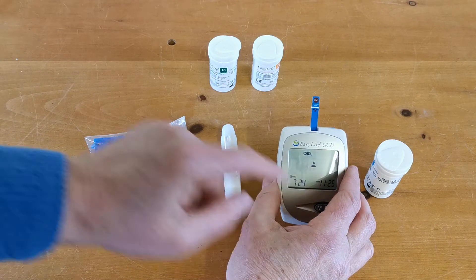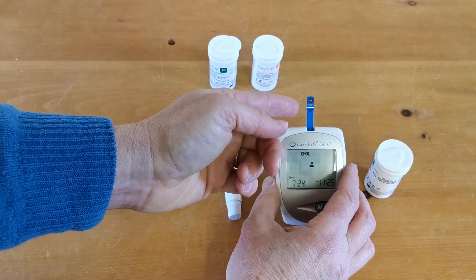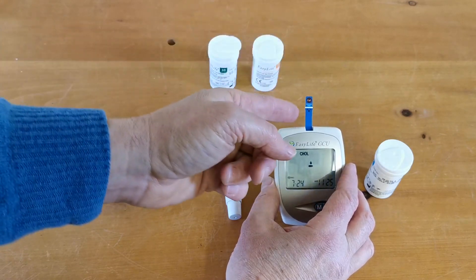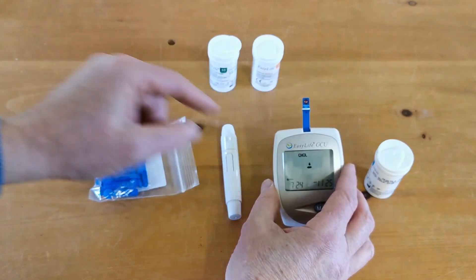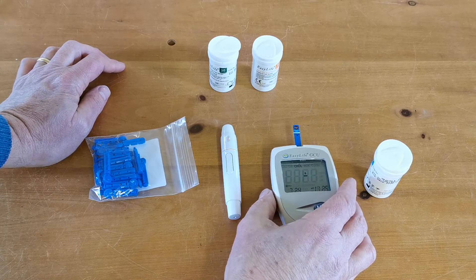You'll see the blood drop symbol — that's indicating that the meter is now waiting and ready for you to apply blood into the side port on this test strip. It goes into the side port here along the white line on the test strip, and that is now ready for a blood sample.